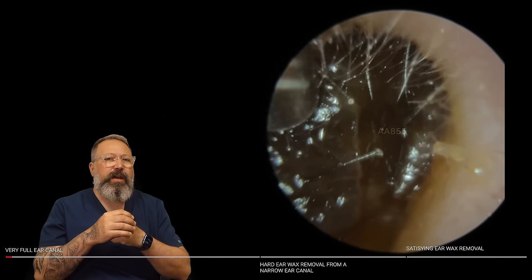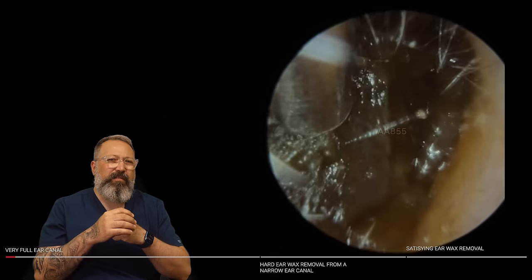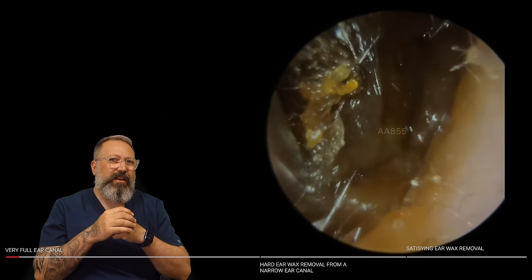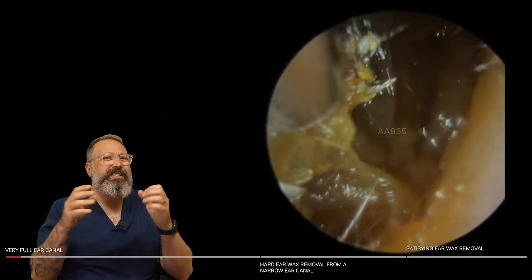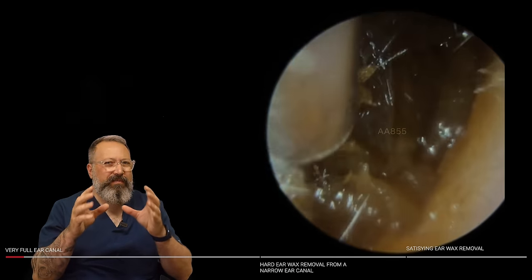We'll have dark wax in this one, quite a dark ear canal as well. So it's very, very thick. It looks sticky, this wax — very, very sticky. Always a difficult one to remove when it's this kind of consistency.